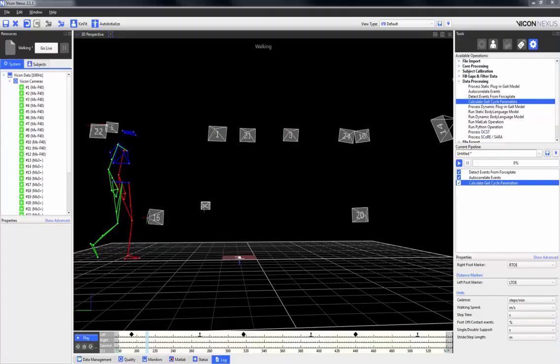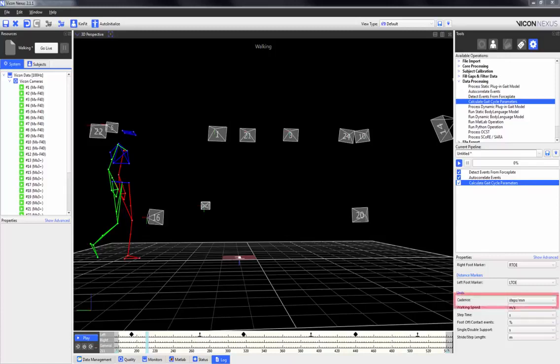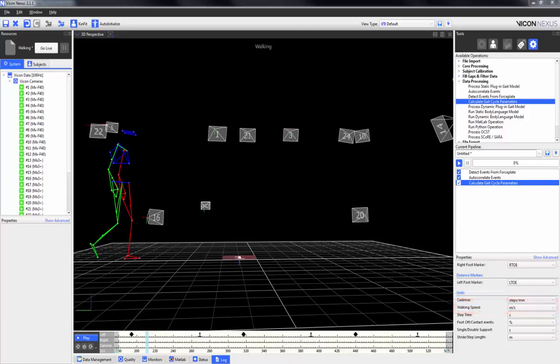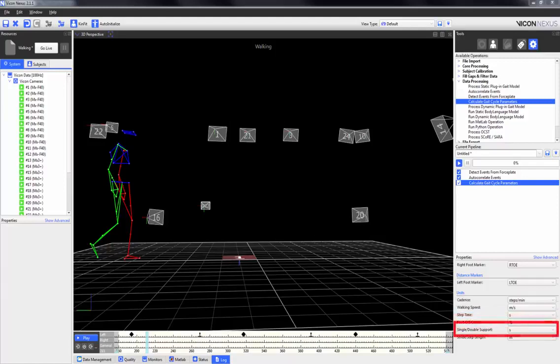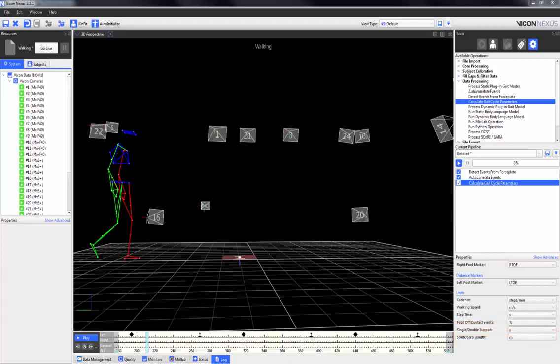Once gait cycle events have been placed in the time bar, the calculate gait cycle parameters pipeline operation can be used to calculate the cadence, the walking speed, the step time, the foot off and contact events, the single or double support, and the stride and step length parameters. All of these parameters can have their units adjusted.